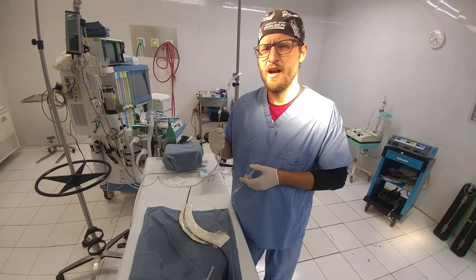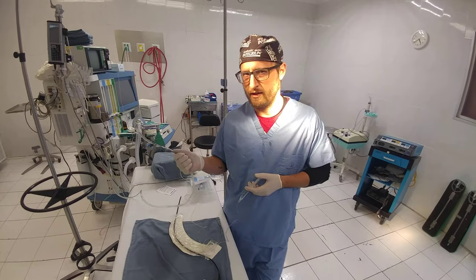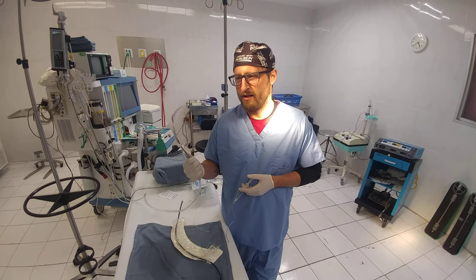We're just going to start topicalizing. I don't really worry about the tongue. I just kind of work deeper, and I'm mainly aiming for the vallecula and the epiglottis and a little bit of the arytenoids.